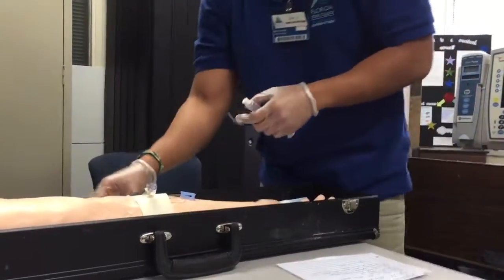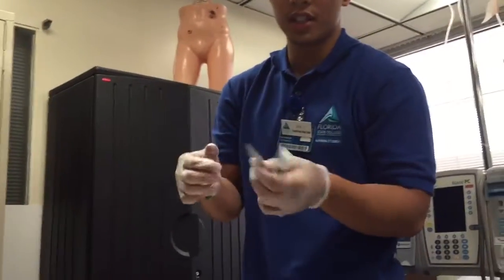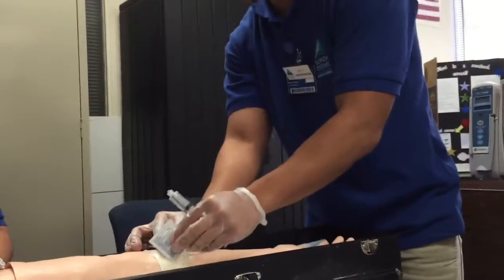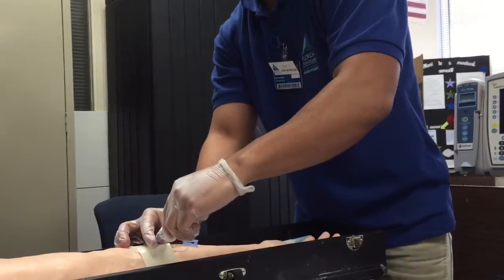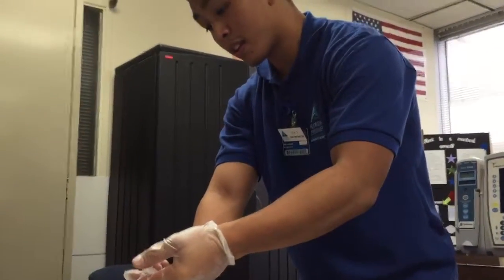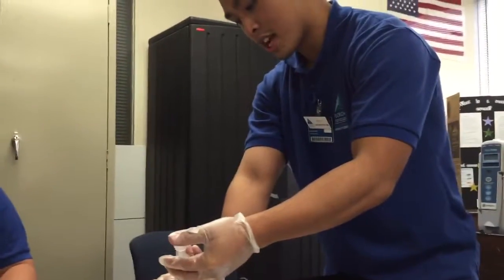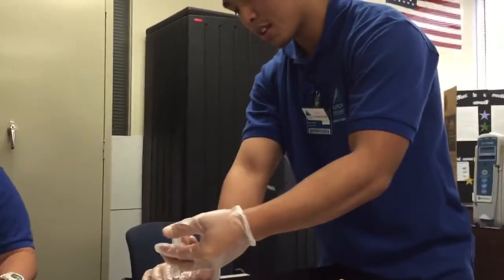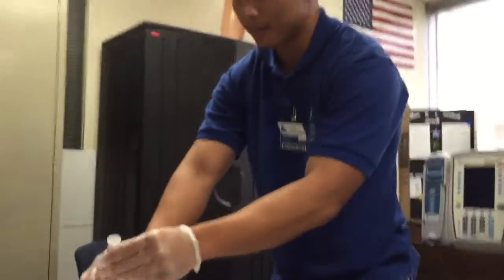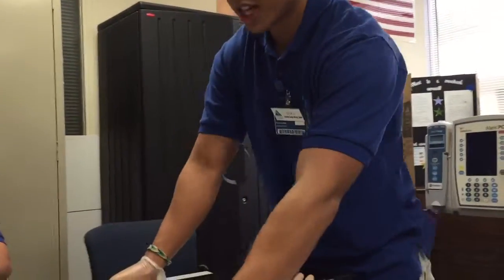So once again I would have to do the saline. So I would take another alcohol swab. This is a brand new flush, or you could use it from earlier. So I'm going to clean the port with that right there. Alcohol, dispose of that. I'm going to once again plug this up. I'm going to do the push stop method with about another 3 milliliters of saline. So push stop, and push stop. Applying positive pressure, I would reclamp this and disconnect that. And then dispose of all my unused supplies into the trash can.